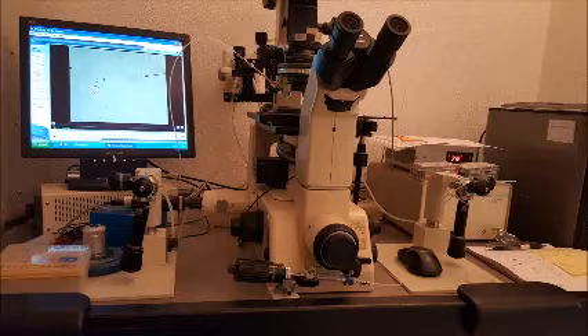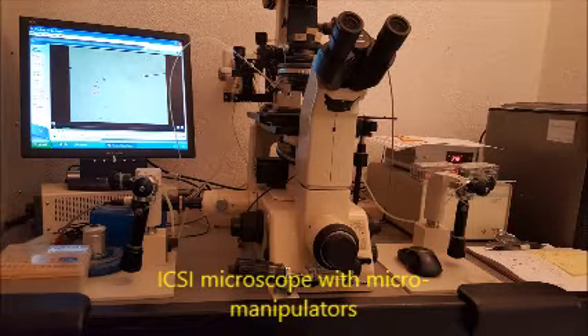These are the same cups that we use to filter embryos. The difference being that the aspiration media from oocytes contains blood and cellular debris, which you do not see in an embryo flush.